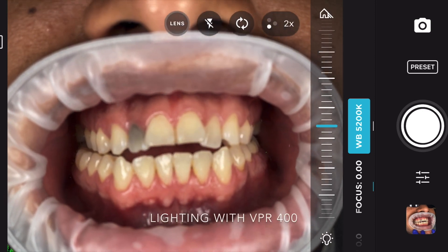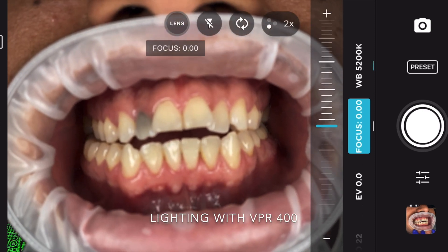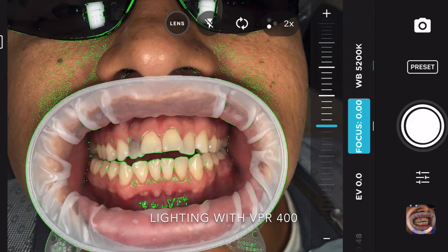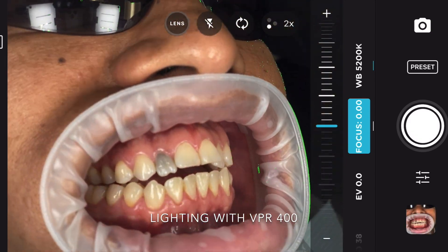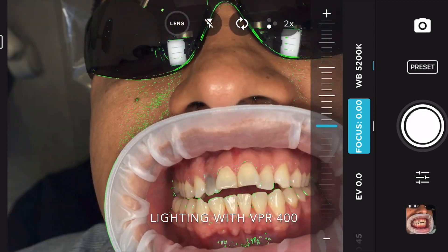Next, we're going to set an autofocus distance. This app is geared towards videographers, and so the minimum focus distance is not quite as close as you can get with a normal iPhone camera app, but one cool thing is we can set it at minimum focus and then move the teeth in and out.